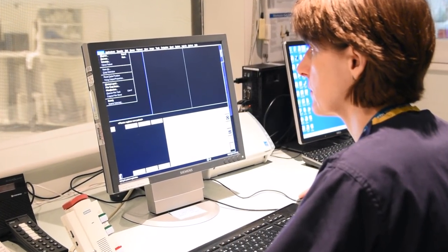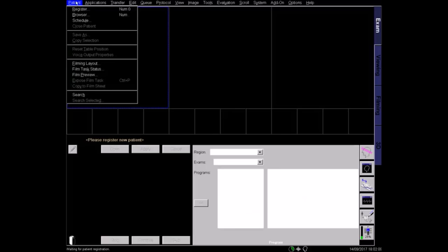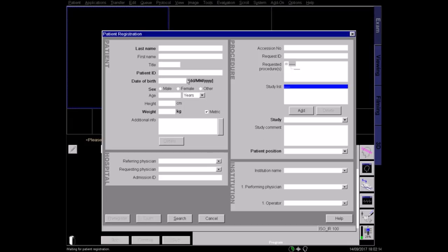Once at the workstation, select the patient in the browser, or type in the details manually. Make sure that the details are entered correctly, including the patient weight, so that the specific absorption rate, or SAR, can be calculated accurately.